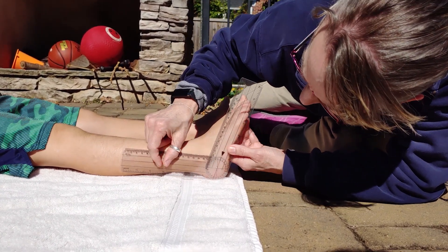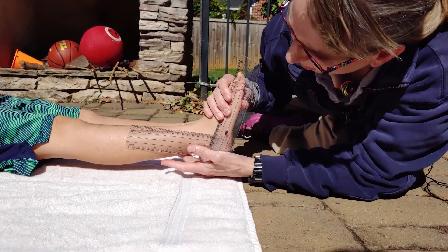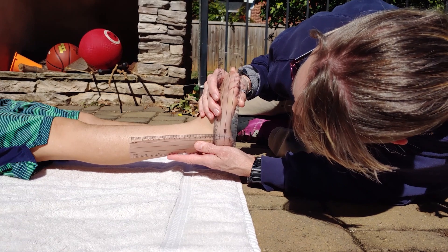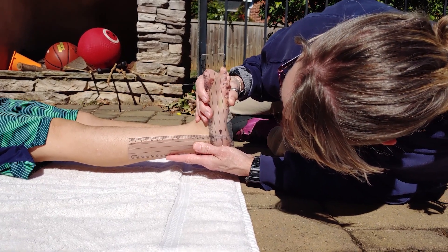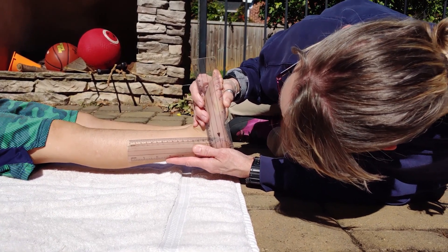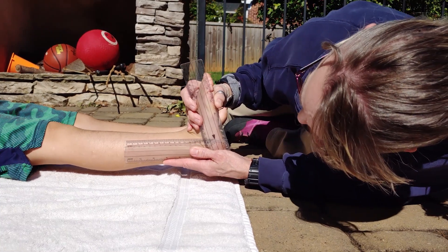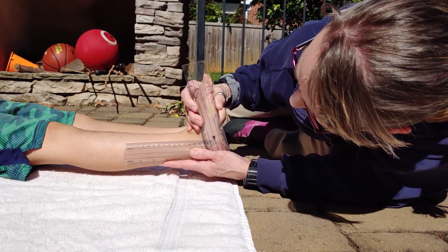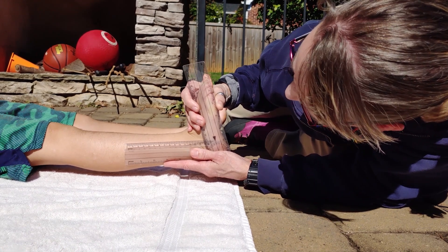Normally you should have 15 to 20 degrees — so that's neutral right there — and then that's 5, 10, 15, and that is 20 degrees. So he has normal dorsiflexion range of motion. That's where your foot goes up.